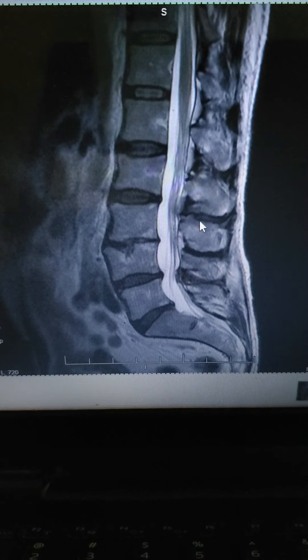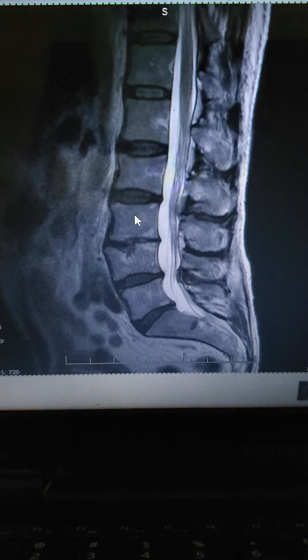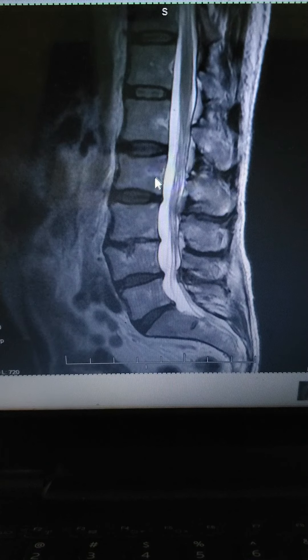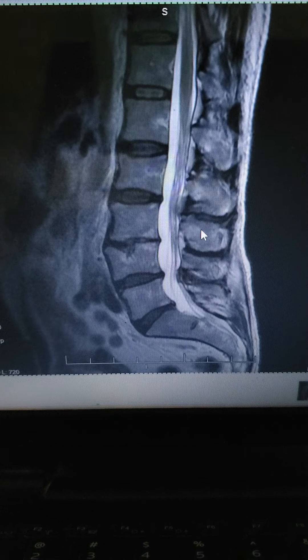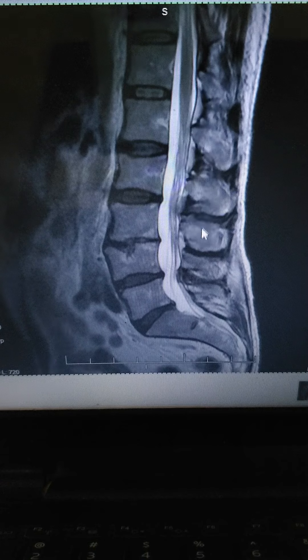This is a sagittal view of my spine. We're about in the middle of the spine. You can see the vertebrae, disc, vertebrae, disc. The spinal cord is over here. The lamina, spinous process, and facet joints are back here.